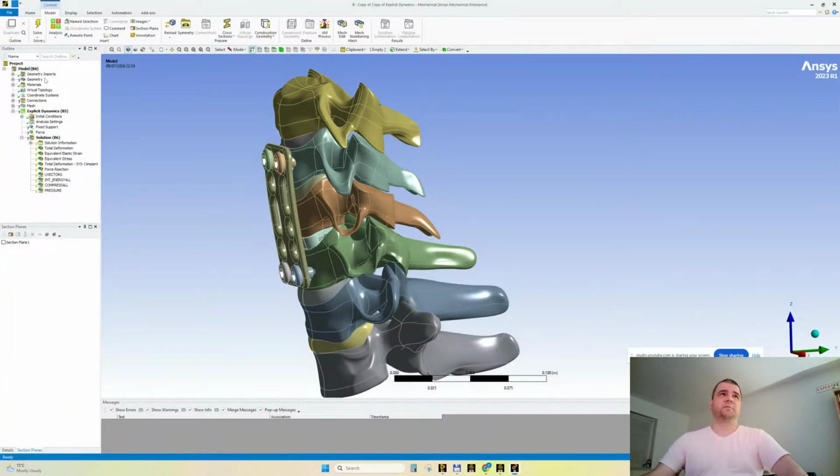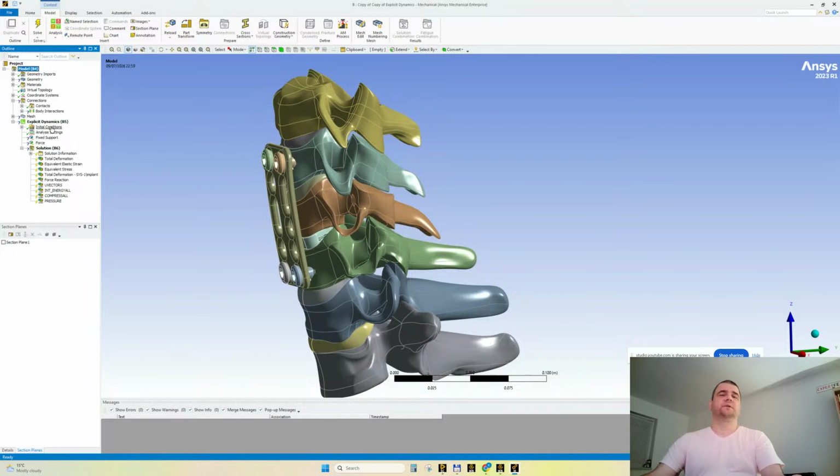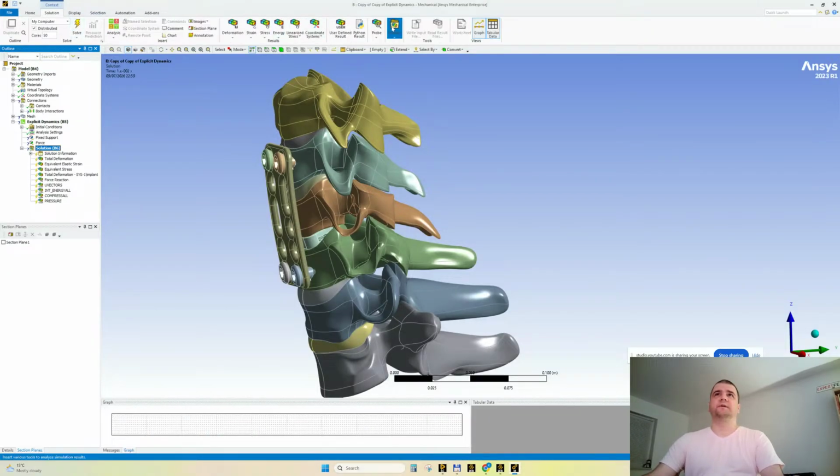the best. We don't care about materials at this moment. What we do care about is whether it is meshable or not, the entire assembly. So let me prove to you that we don't have a contact tool. We cannot find out the pressure and stress, whatever, in the contacts. This is a disadvantage of Explicit Dynamics.